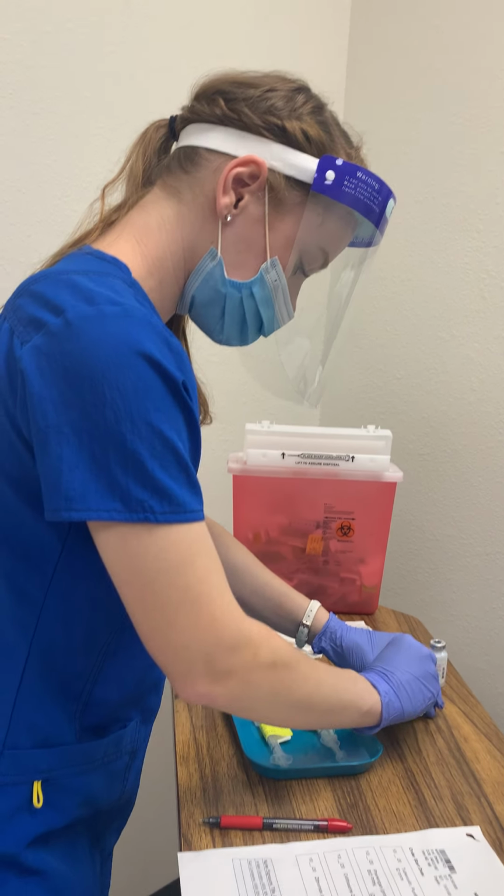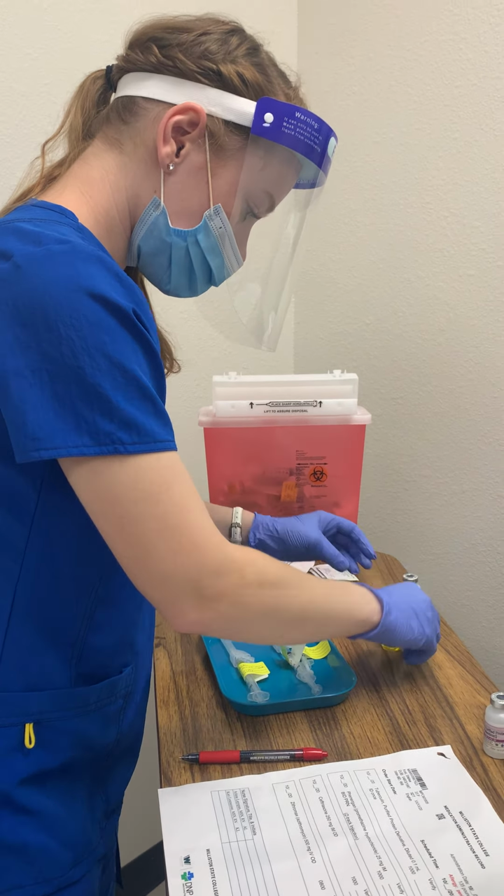Okay, so perfect. And then I'll be checking this because I'm not gonna be administering this. I'll just do my third one. So we've got my ceftriaxone. We've got 250 milligrams, and then we've got 0.5 ml, correct? And then it's not expired. Time, perfect, still 9:55, so we're good. Ceftriaxone, so perfect, so I can set that aside. And it's not expired, it expires at 10 a.m.